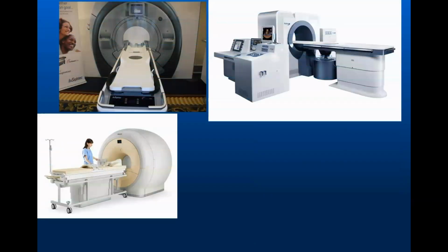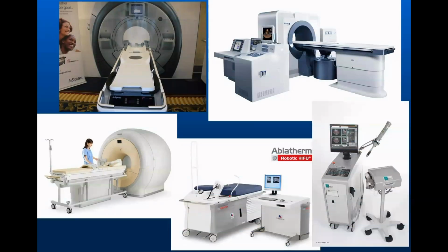First, before going into it, I just wanted to put some images here to show you an important concept, because we said HIFU is focused ultrasound, right? Which is correct. But remember that we do not have a needle in the lesion. So how would we know that the ablation is happening? And how would we know the extent of ablation? Are we under or over ablating? We do not know because we do not have a needle inside. So we will use imaging. You can actually use ultrasound to see what you are doing. This is called ultrasound guided HIFU. Or you can use MRI to see what you are doing. This is called MRI guided HIFU.